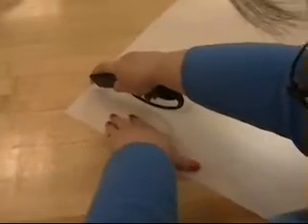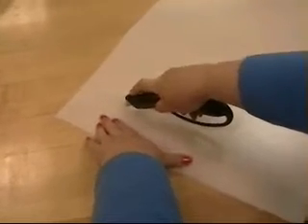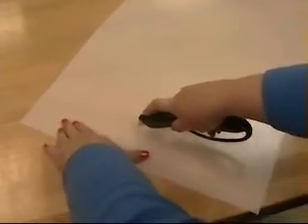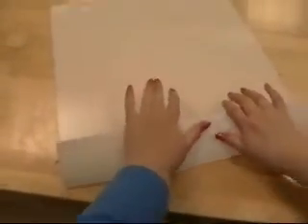When making the finger trough splint, we don't really make a pattern. What we do is just cut a piece of material of the appropriate size and width. And I start doing that by cutting the strip of the 1/16 of an inch material to approximately the right length, about 4 to 5 inches. And so I'm going to score it with the X-Acto knife and fold it over.